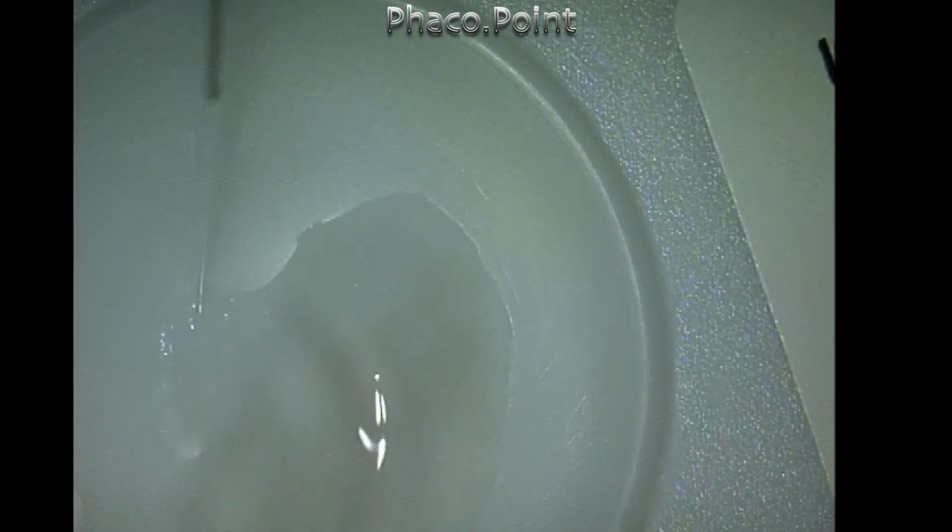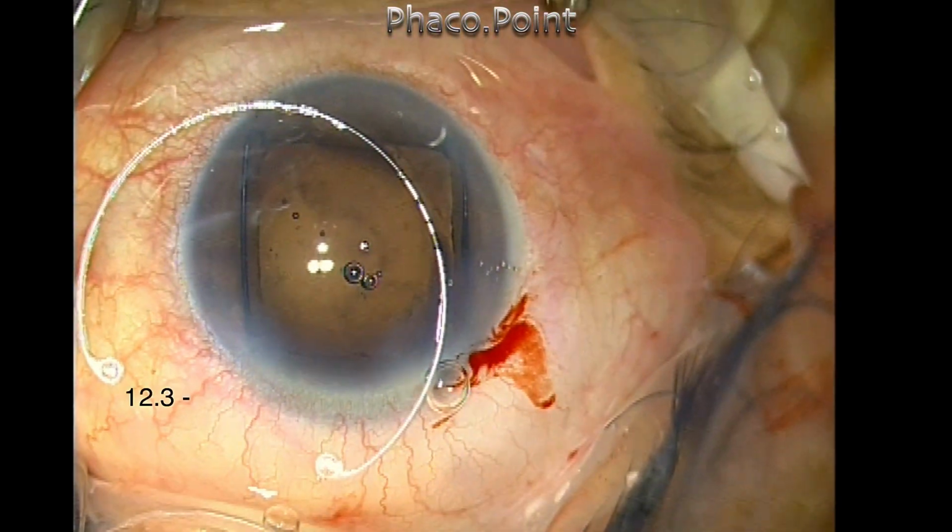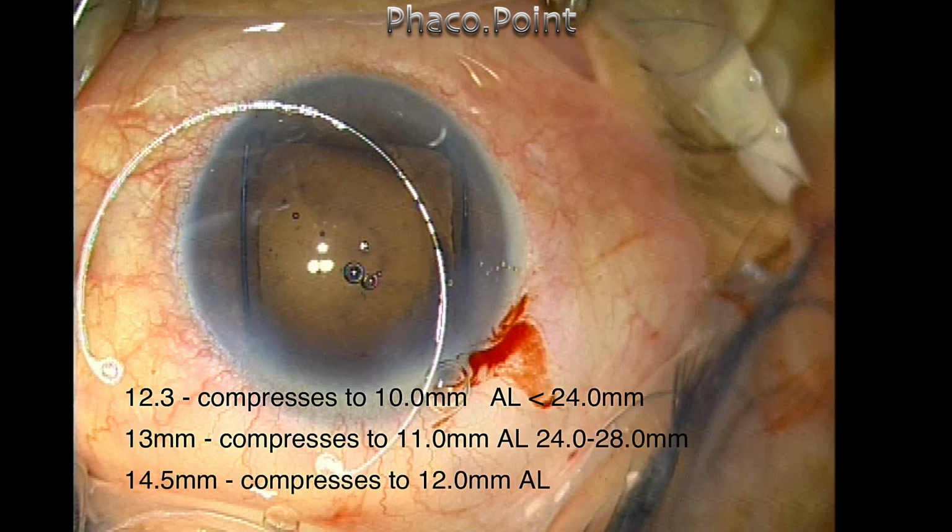Now before using a capsule tension ring, you first have to rinse it in balanced salt solution. You fill the small depression that is seen in the packaging itself to get rid of free radicals due to ETO. Three sizes are there: 12.3, 13 and 14.5, which are used for axial lengths of less than 24, 24 to 28 millimeters and more than 28 millimeters. The capsule tension ring is made of PMMA material and therefore it can be compressed.